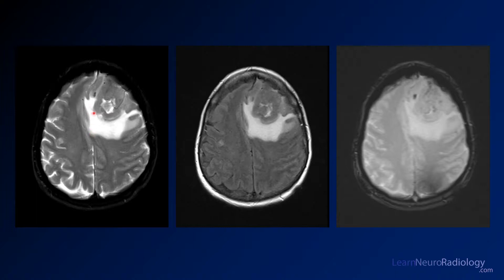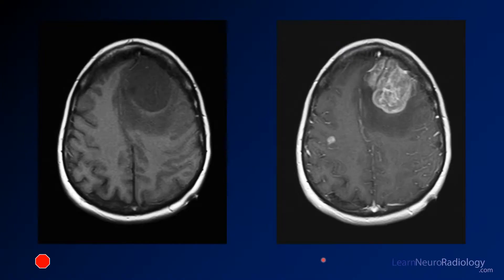On T2, there is a well-defined mass, maybe a little centrally necrotic with a very thick rim. There's a lot of surrounding edema, but the mass itself is relatively dark on T2 and FLAIR, with maybe a little hemorrhage associated. On pre- and post-contrast imaging, the mass is iso- to hypointense and enhances very avidly — solidly enhancing. There's also another enhancing nodule in the right hemisphere, which contrast really helps identify.